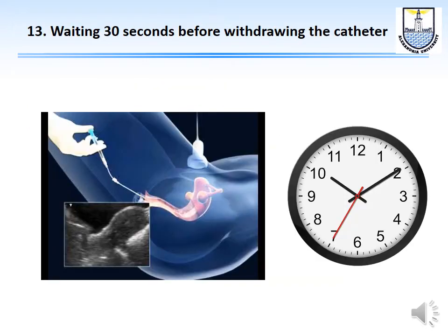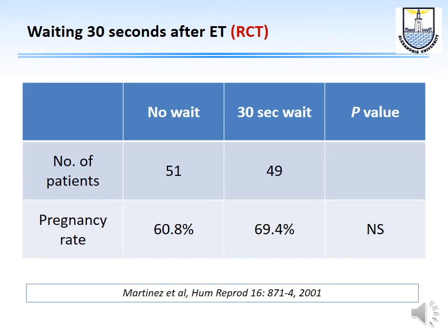What about waiting 30 seconds before withdrawing the catheter? No difference. As you can see from this randomized controlled trial, there are not many patients, 50 odd patients, but at least in this study, there was no difference between waiting 30 seconds or not waiting 30 seconds.